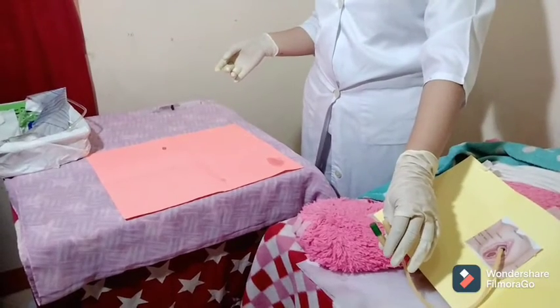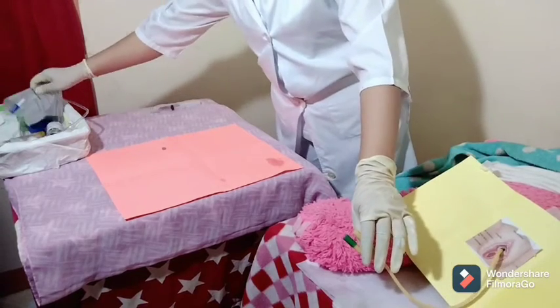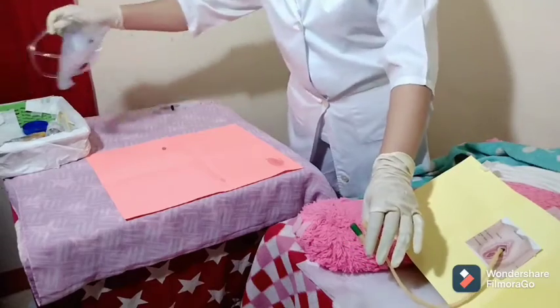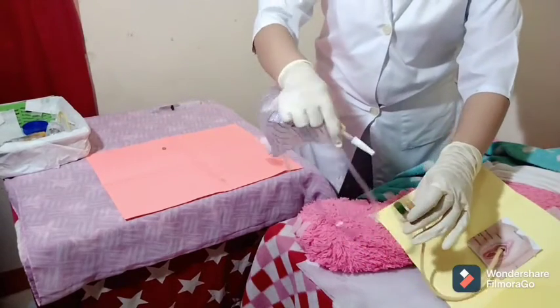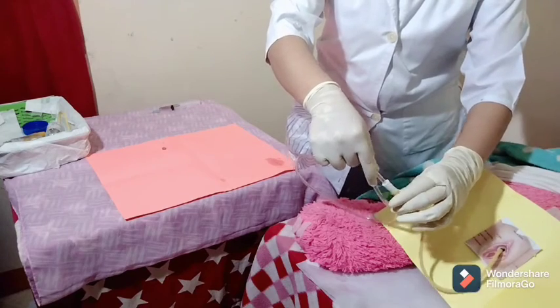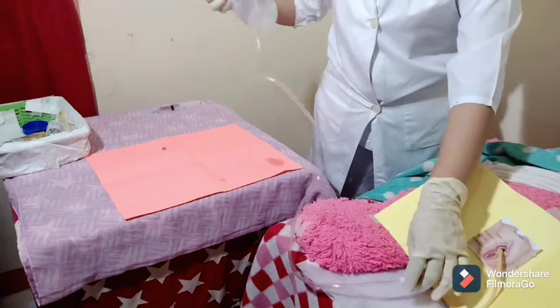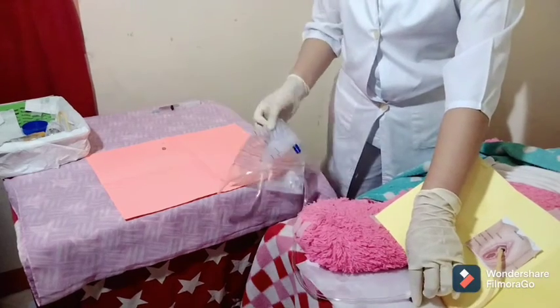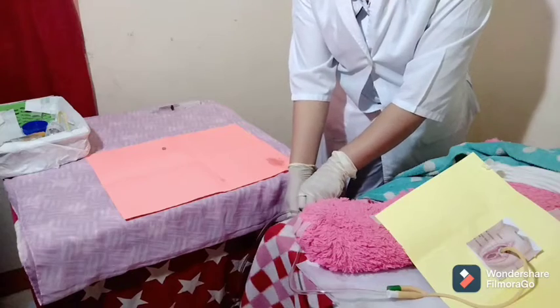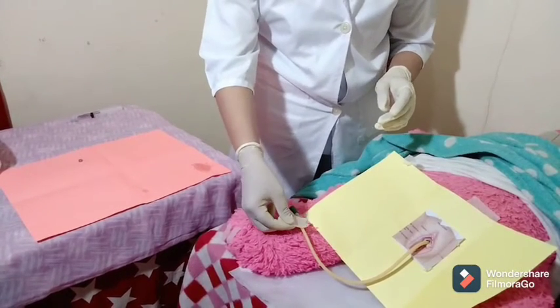Attach the catheter to the urine bag below the level of the bladder. Tape the catheter to the thigh. This is to avoid the reflux of urine and prevent infection or UTI.